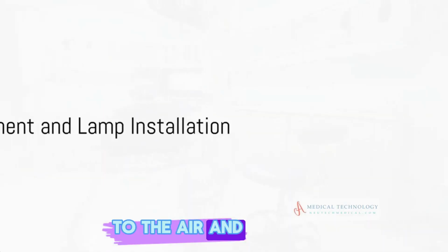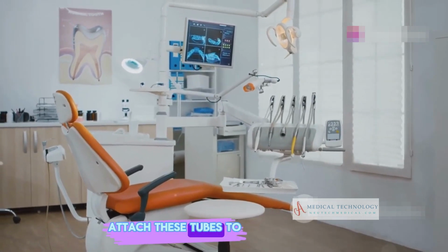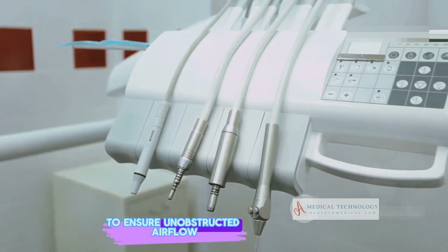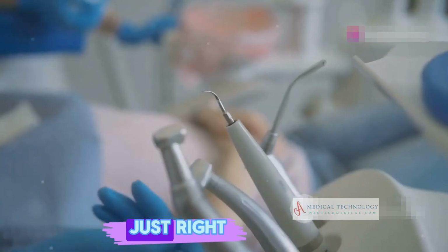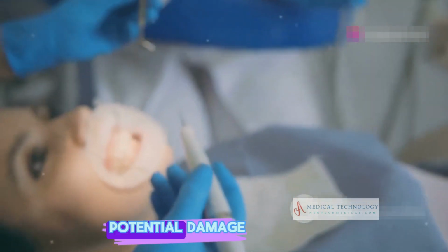Moving on to the air and water tubes, these are the lifelines of the dental chair. Attach these tubes to their designated, often color-coded ports. The goal here is a snug fit to ensure unobstructed airflow and water supply. It's crucial to avoid any kinks in the tubes and to tighten connections just right, not too loose, not too tight, to avoid potential damage.